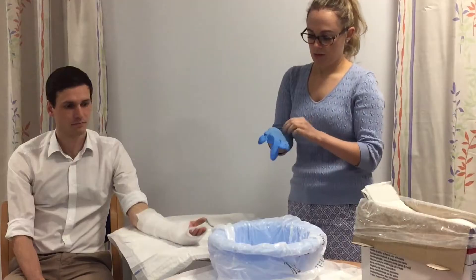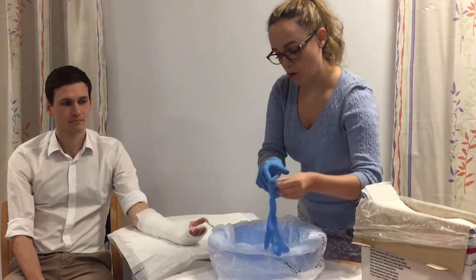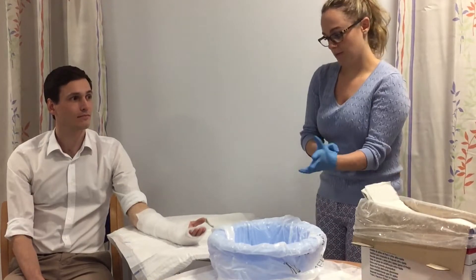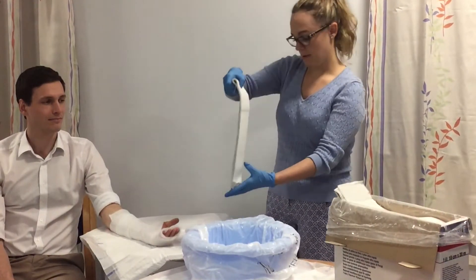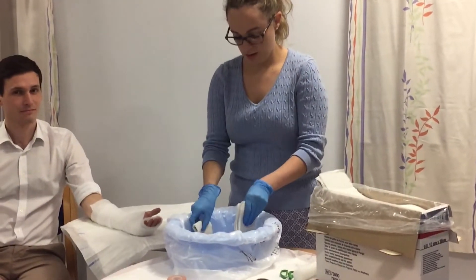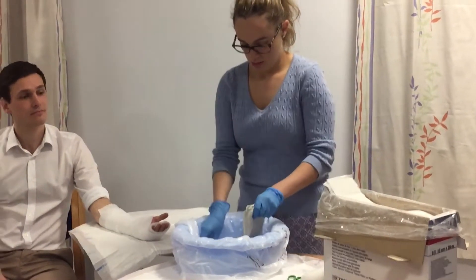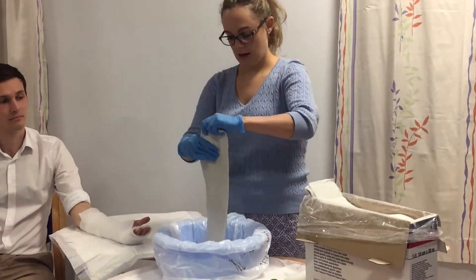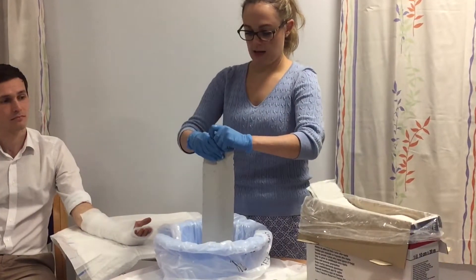The next step is where we need our gloves, because we're going to put the plaster on. We need this bowl of warm water — don't forget to tell the patient it's going to heat up, or they might panic. We take the plaster and just dip it in the water; you don't need too much water, just make sure that it's nice and moist, and then drain off any excess.